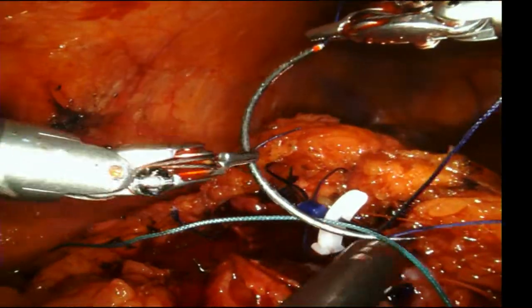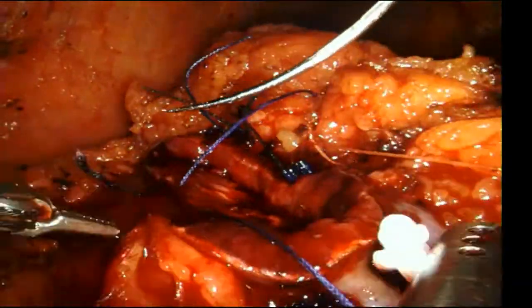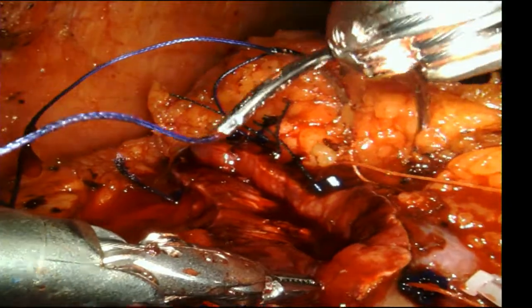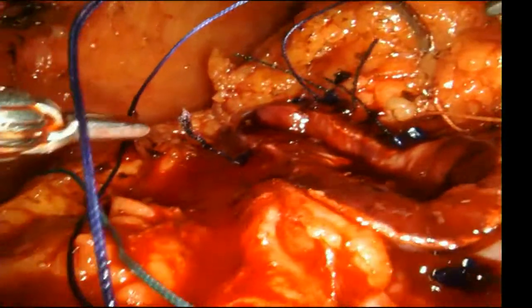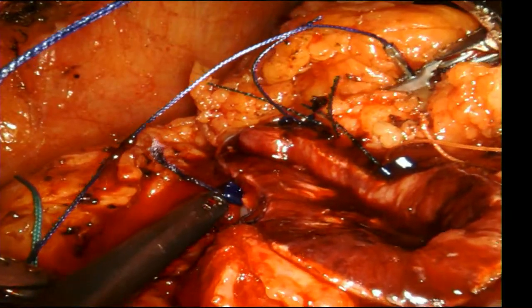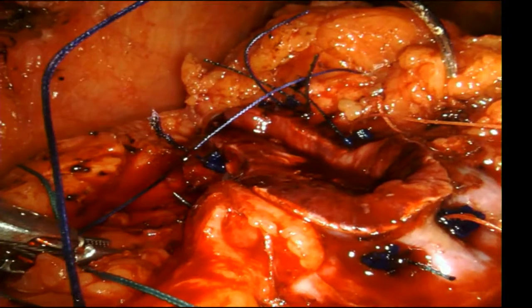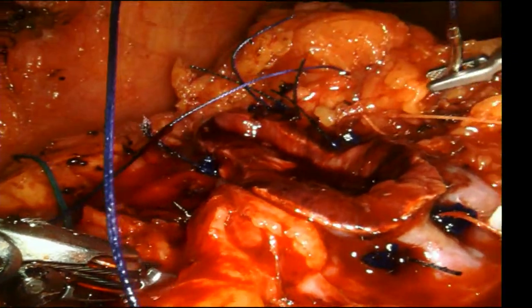So here I'm just alternating these back and forth. I leave that one in the kidney and I do the next one, because if I take this out and tighten it, then it's hard to see where I'm going to put the next one. So I just leave that in the kidney and then I go for the next one. And then I'll leave this one in when I do the last one. Suck on this side right here. I think I pulled this out a little bit here. Keep that in there. And then this one's going to come out. Try to go a little bit over here.